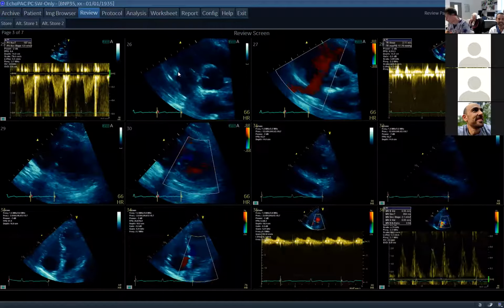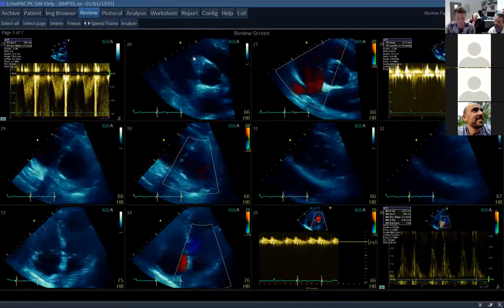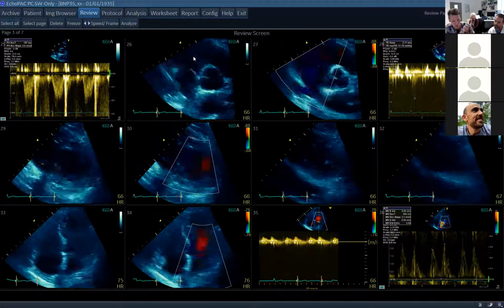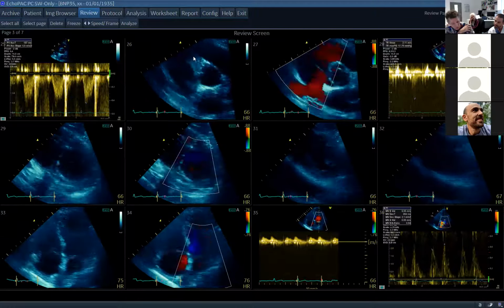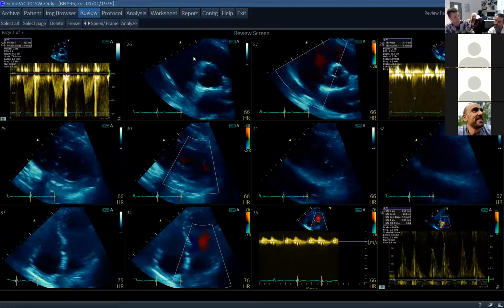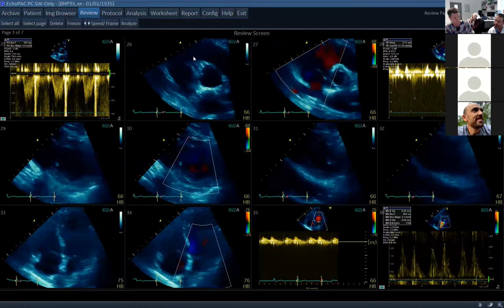And I think that's exactly what I said. My conclusion for this guy when I wrote it says, there is a cardiogenic component to the patient's shock state. This is likely acute and may represent a septic cardiomyopathy. Suggest repeat imaging once acute illness resolved.